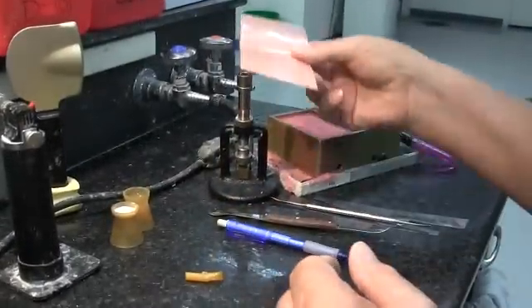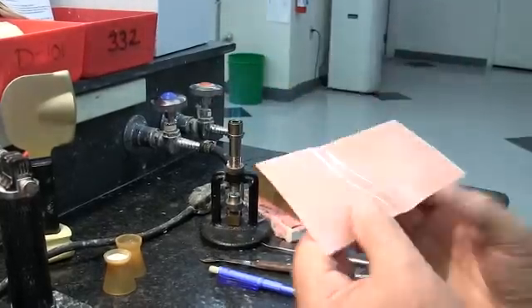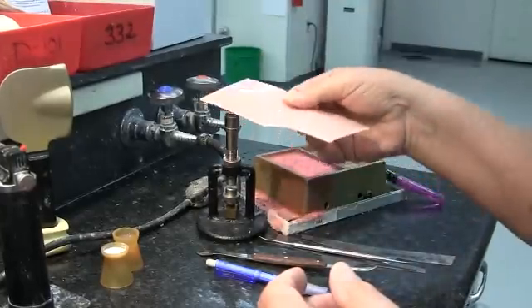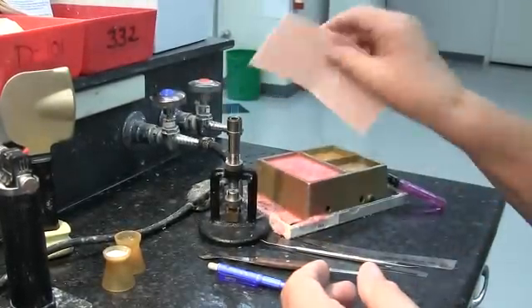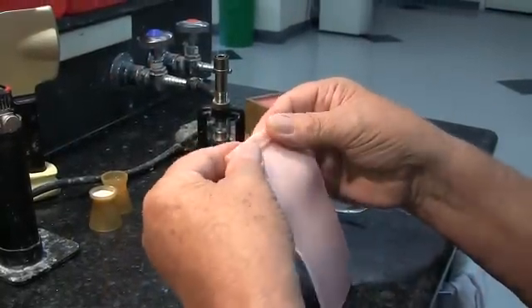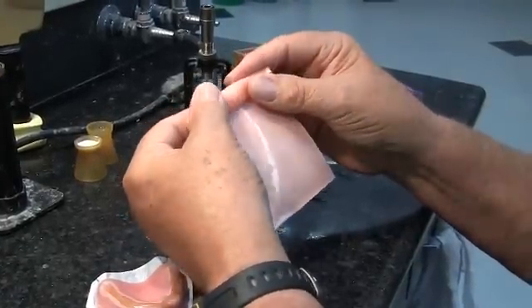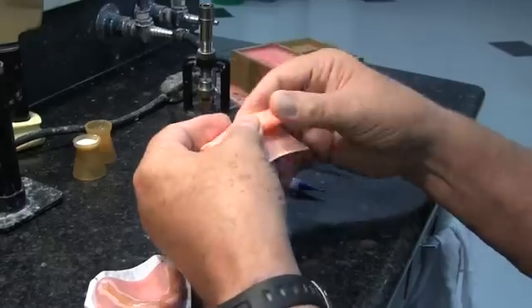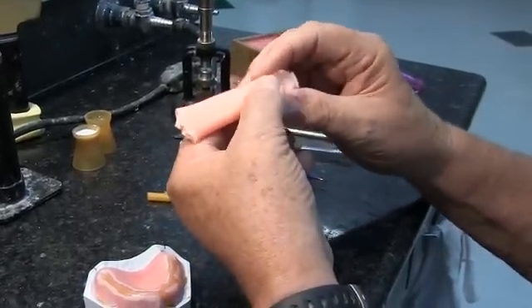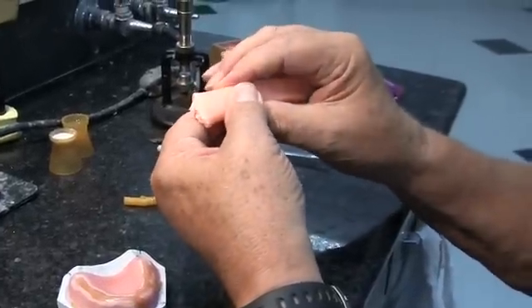Now we're going to begin to heat up a sheet of hard baseplate wax and form it into a strip so that we can place it on top of the hard baseplate material. When you're heating your wax, watch it — it starts to get lighter as it gets warm, and you want to get it warm all the way through. Fold it up, and since it won't be long enough to reach from the distal of the first molar on each side, we're going to form it into a horseshoe.